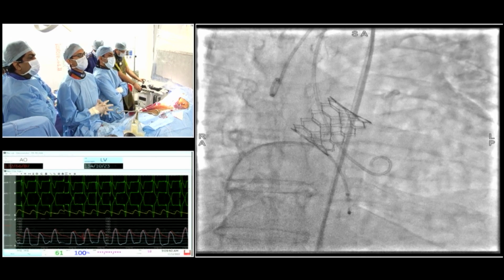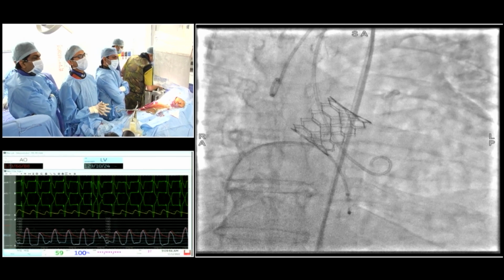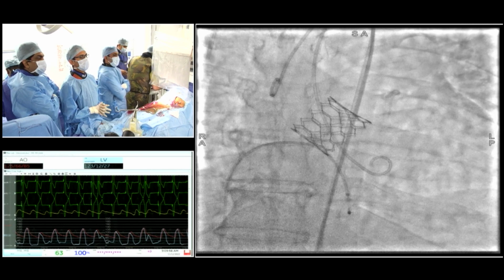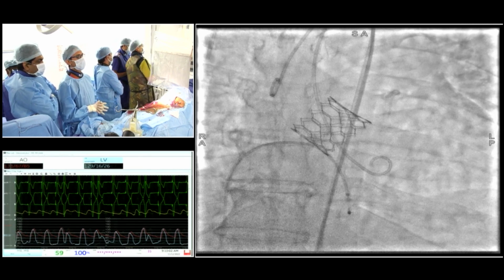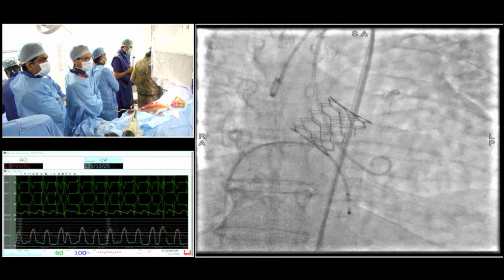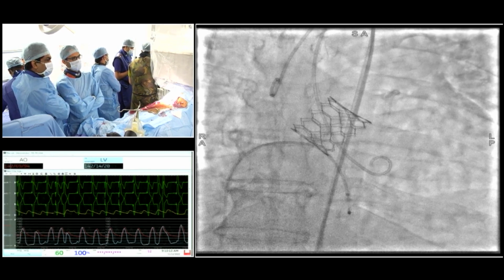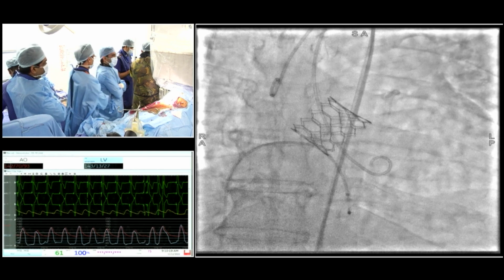Your comfort level is higher when very tight aortic stenosis has been pre-dilated. Second, bicuspid valve, for sure, everybody will pre-dilate. Third, a very heavily calcified valve where you find that the entry could be difficult; instead of struggling, you predetermine to do a pre-dilatation. And fourth, when you are in doubt about sizing, or when you want to make sure whether the coronaries are likely to get obstructed or not, then also you pre-dilate.